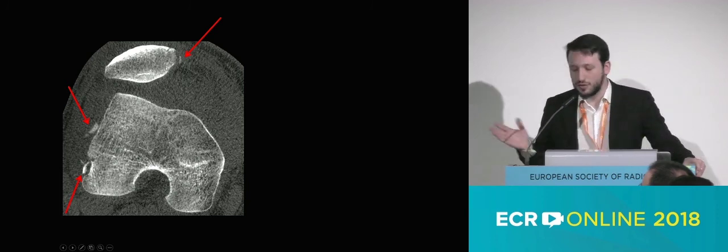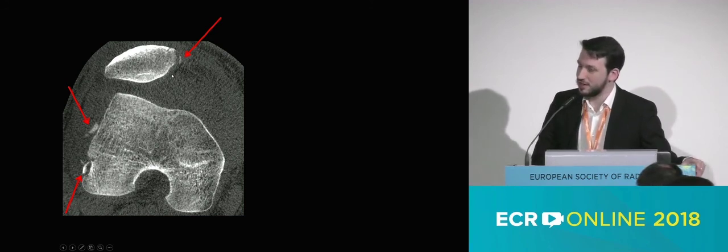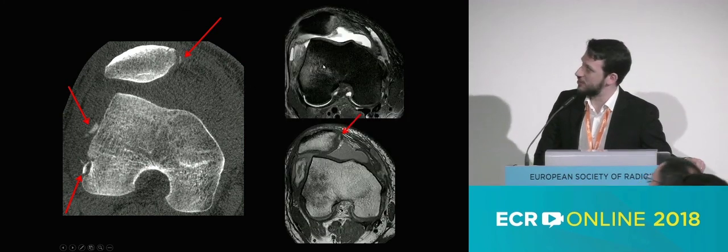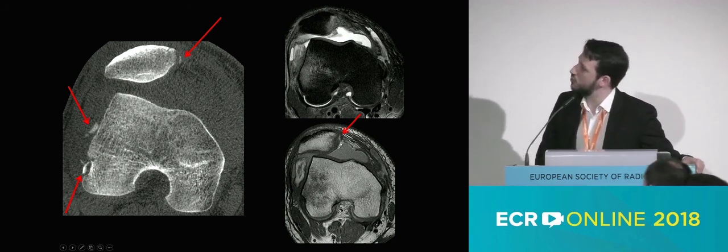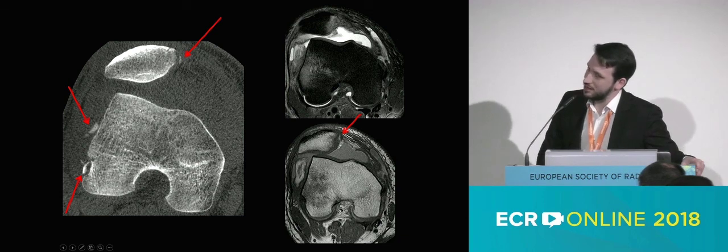This is interesting, but of course you could have had this kind of images with a high resolution CT, but in the end I think we did the CBCT mostly because we knew that it was less irradiant. Maybe we wouldn't have performed CT on this patient. She had an MRI, I think 1 week after, and we found this classical pattern of marrow edema. Usually with these kinds of patients, you see them in MRI, and you may guess that there may be some little avulsion. So the CBCT that was performed really helped us in seeing these microavulsions, and you know that these intra-articular loose bodies can worsen prognosis.